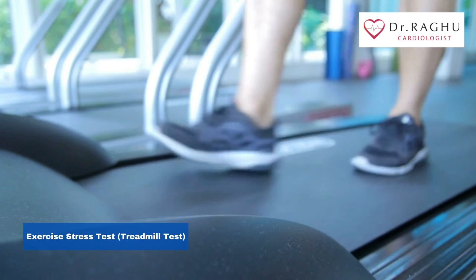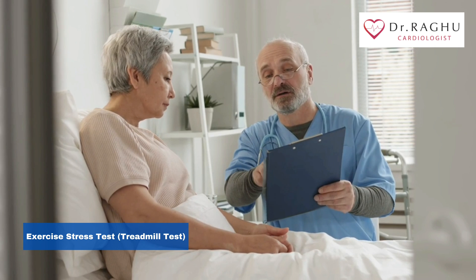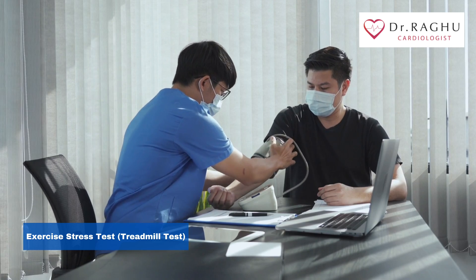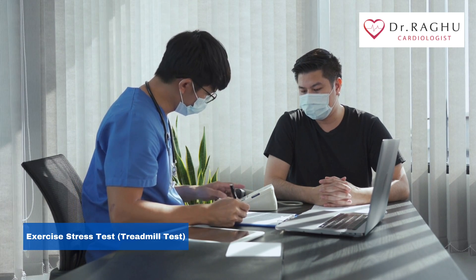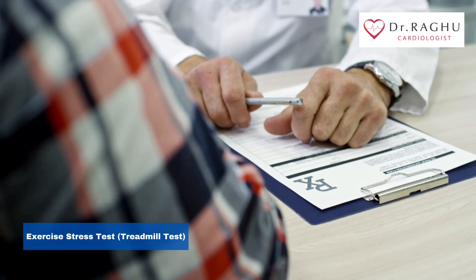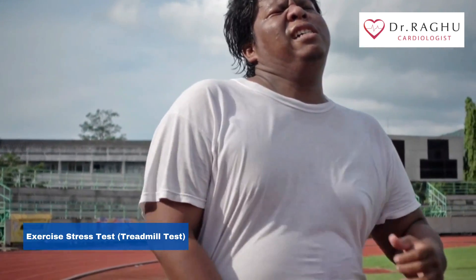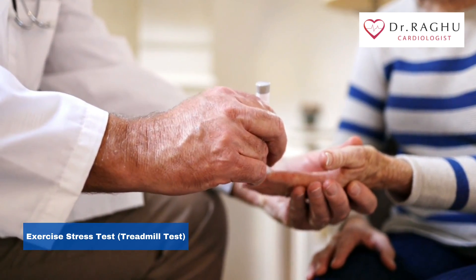Prior to your test, your doctor will perform a physical exam and ask about your complete medical history. At this point, tell your doctor about your symptoms, especially any chest pains or shortness of breath. You should also tell your doctor about any conditions or symptoms that may make exercising difficult, such as stiff joints from arthritis. Finally, let your doctor know if you have diabetes because exercise affects blood sugar. If you do have diabetes, your doctor may want to monitor your blood glucose levels during the exercise test as well.